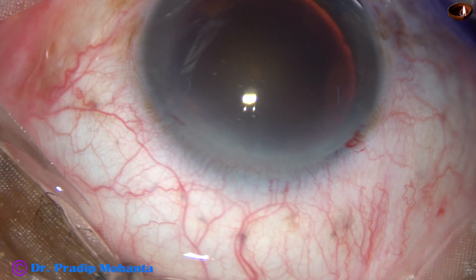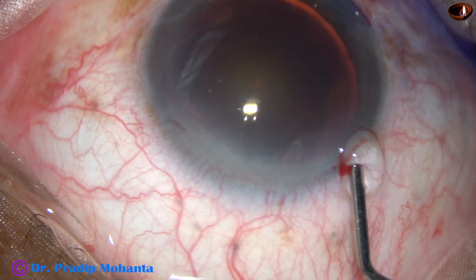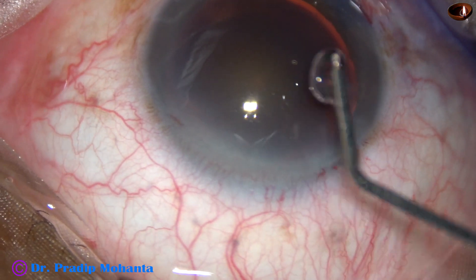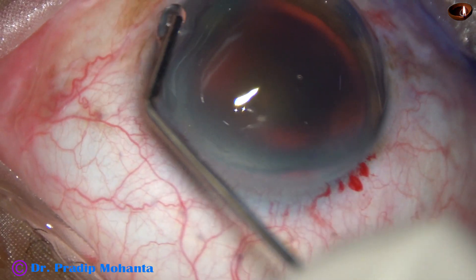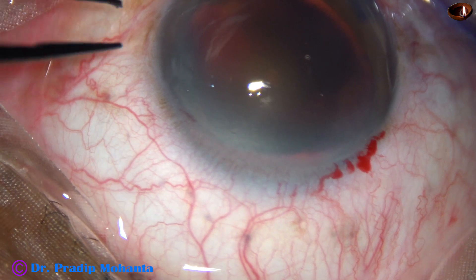2% hydroxypropyl methyl cellulose is used to fill the anterior chamber. The methyl cellulose is applied over the corneal epithelium for better visibility, and it also protects the corneal epithelium.